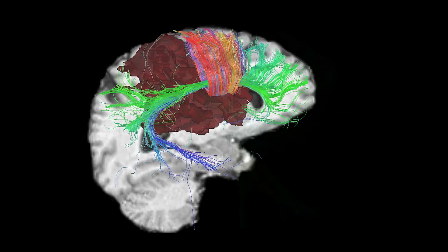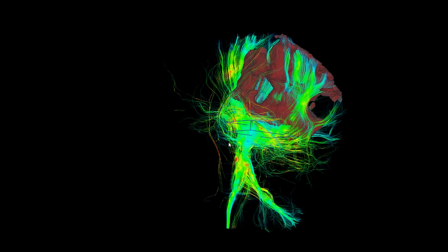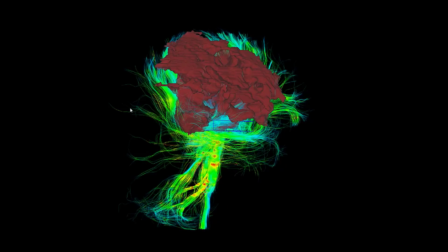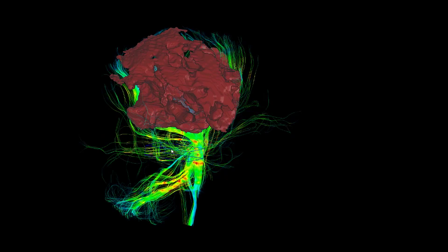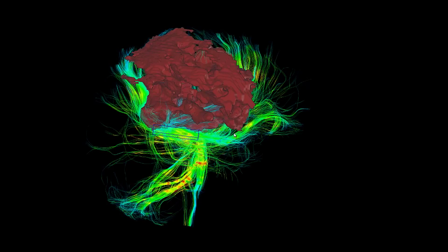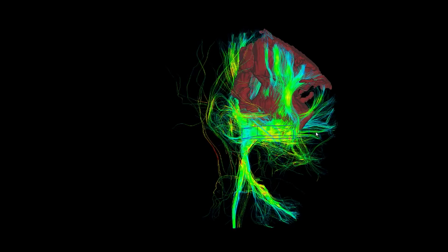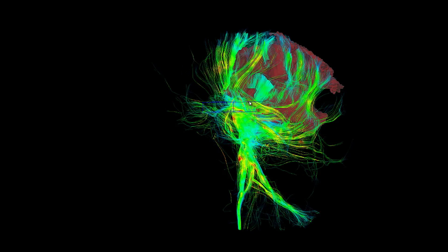Now we go on the tumor side — that's part of the image you saw before. You see the corticospinal tract coming from the spinal cord. We're moving the box around the tumor, so you see how the tracts deviate around the tumor and also infiltrate here. We see really at the medial part of the tumor a lot of tracts coming through it, and these are motor tracts.